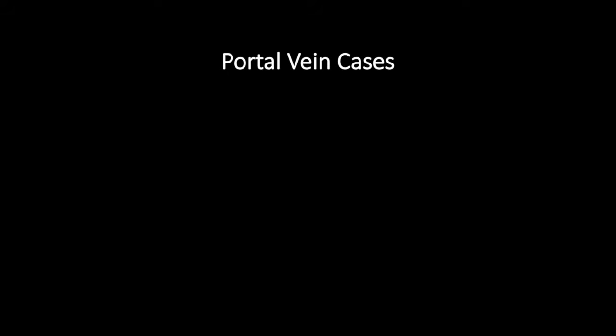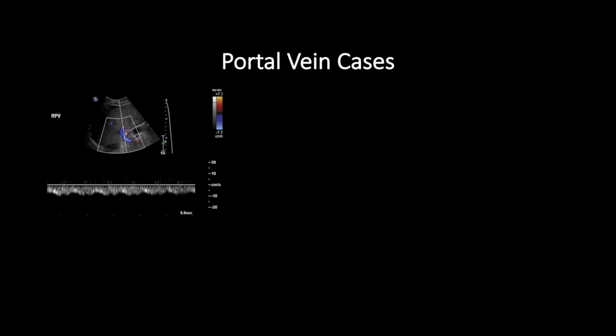And so let's look at a few cases in the portal vein and apply these principles. So this is the first case, so have a look.